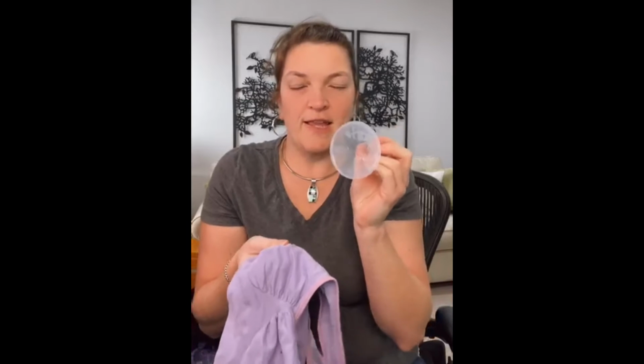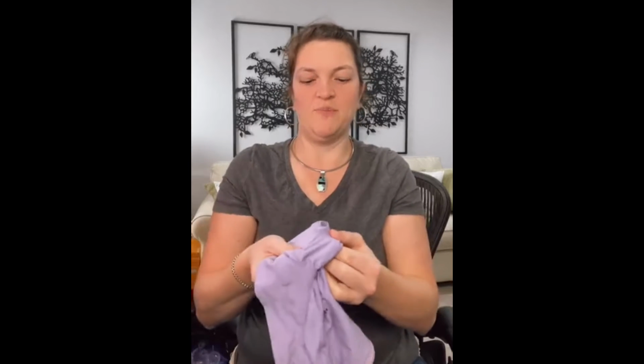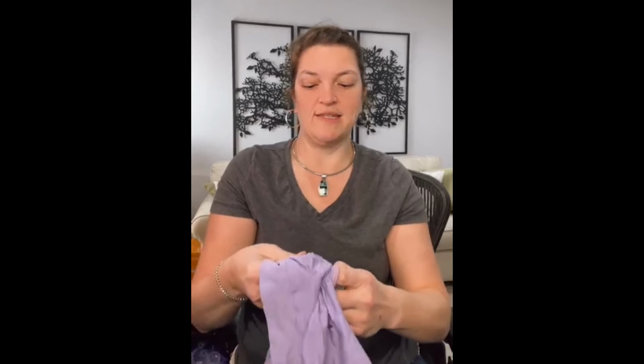If you have a flange that detaches like your Medela pumps, then this is really the easiest for the hack. But what you're trying to do is see if it's big enough to then poke through that hole. You want it just big enough. You don't want a massive slit because then it has the potential to move around and not stay where you need it. Trickier flanges obviously are your Spectra flanges, but you basically want that slit just big enough that one of these ends can slide through that hole.